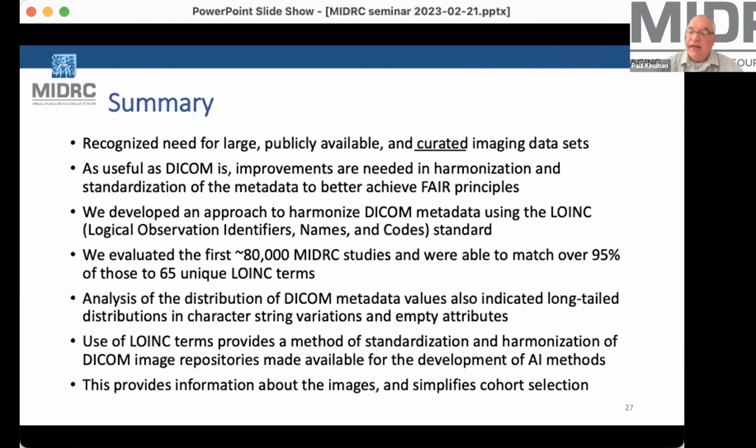And both the RSNA and ACR have technology stacks that use both automated and human reviewers to look at images to be sure that it's properly de-identified. And there's some evaluation that they're using methods that are roughly the same, with roughly the same profiles for the metadata de-identification, but there's also some interest in using automated methods as well.